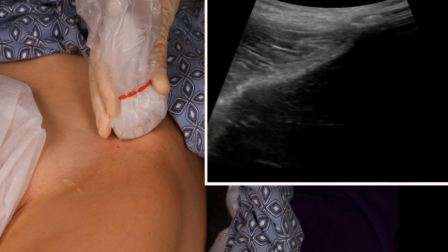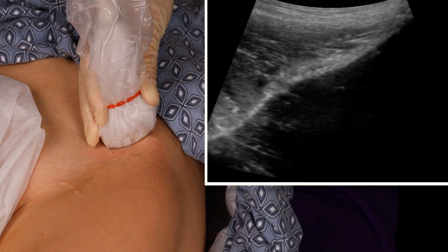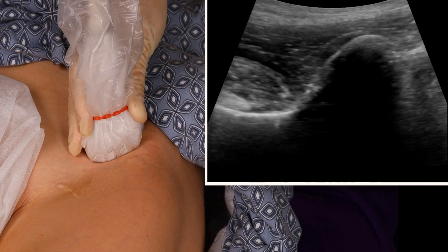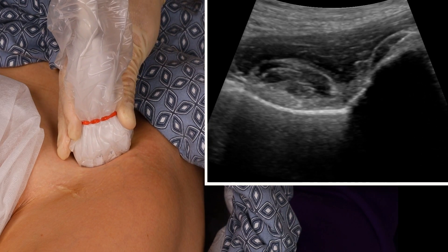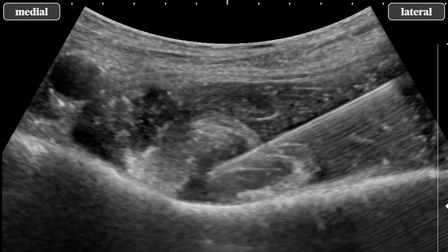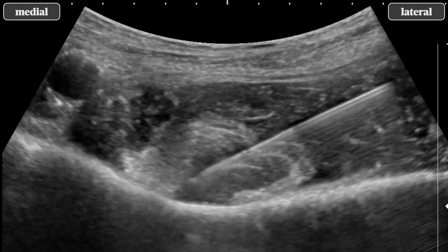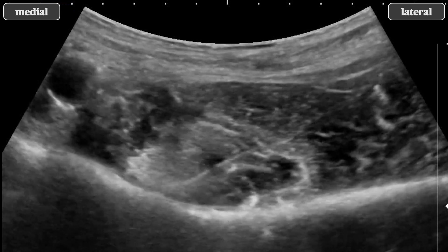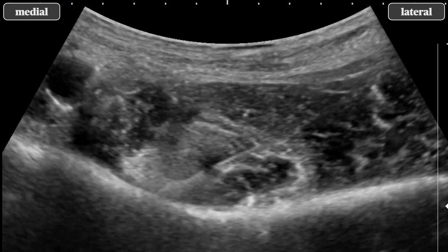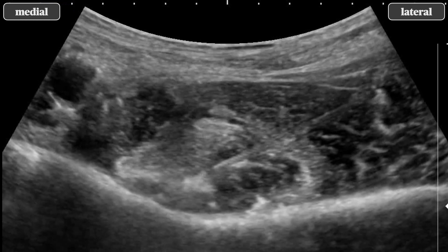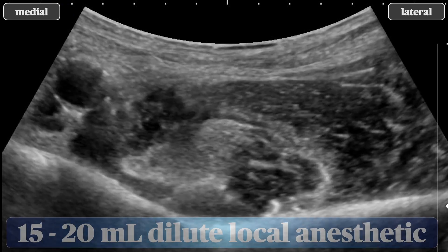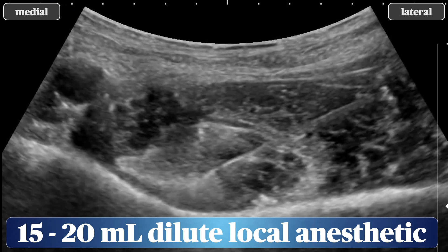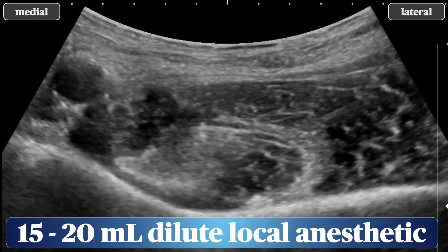Alternatively, if the ASIS is easily palpable, you can start by scanning for that bony landmark and then following the pelvic brim in an inferior medial direction. A needle is advanced from the lateral aspect until contact with the pubic ramus is made just lateral to the psoas tendon. A small injection of saline is administered to confirm the needle tip is not intramuscular or in the tendon. Following this, a total of 15 to 20 mls of dilute local anesthetic are administered. These are small nerves, and you don't need highly concentrated local anesthetic to get a good effect.